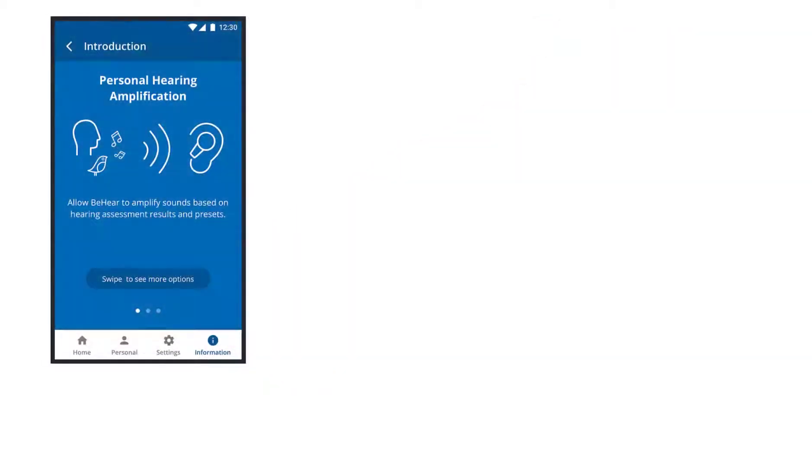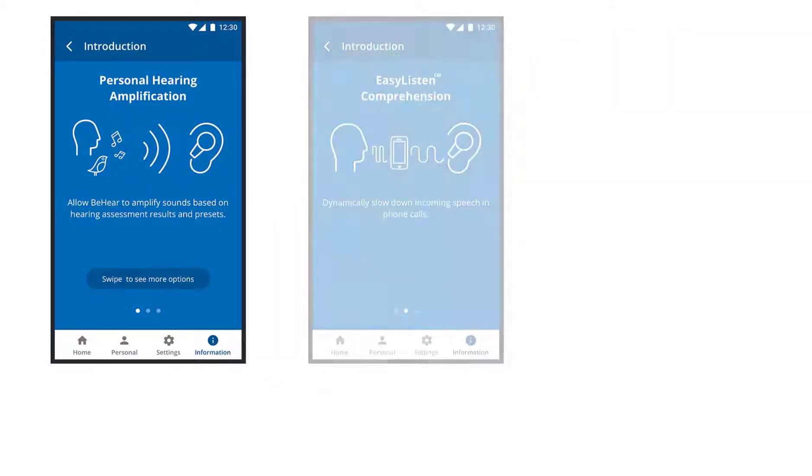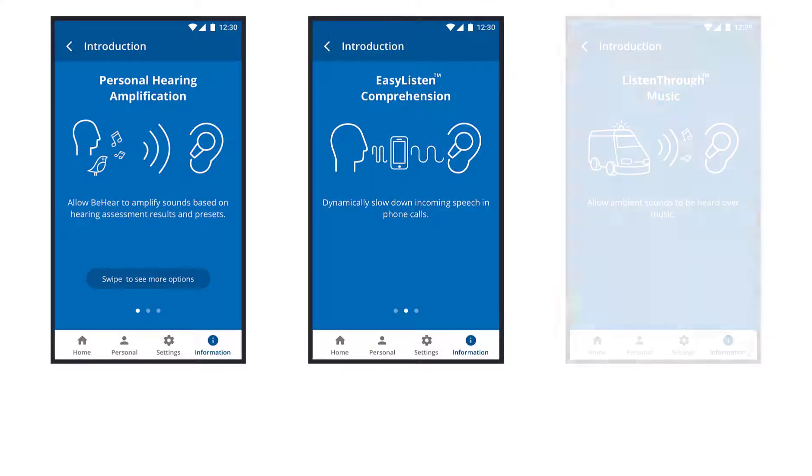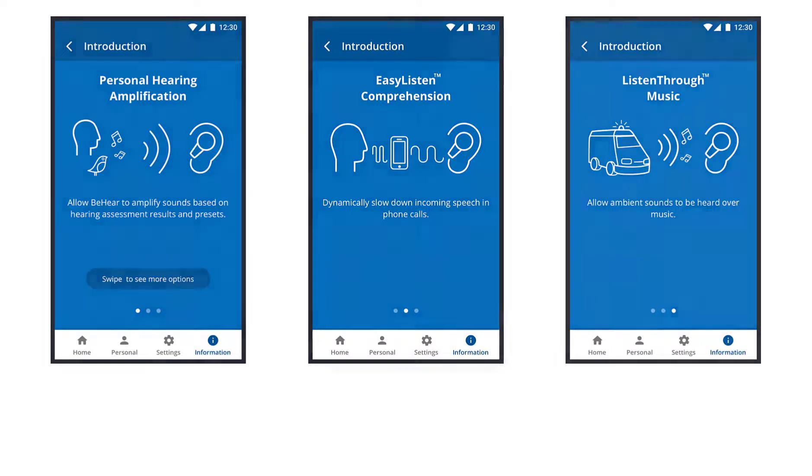The first time you open the app after you accept the terms of use, it will go straight to the introduction screens. These give you a quick overview of the features in the three main hearing modes.